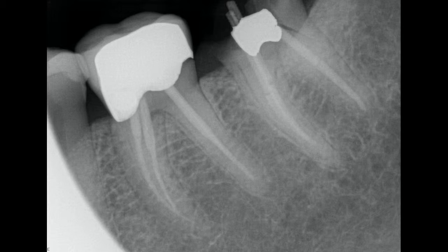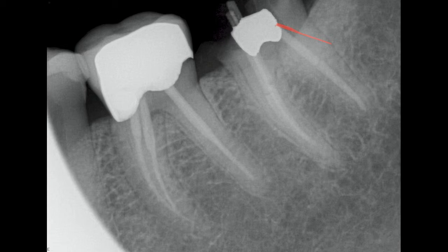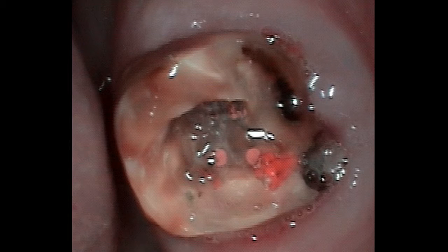When I saw her the first time, I showed her on the digital x-ray where there was a significant fracture on the back of the tooth. This is how her tooth looked in the mouth. The root canal access was open to the oral cavity, and there was considerable decay present.